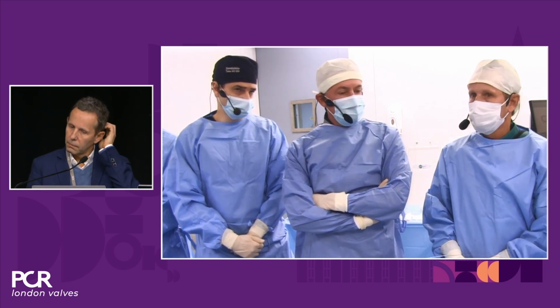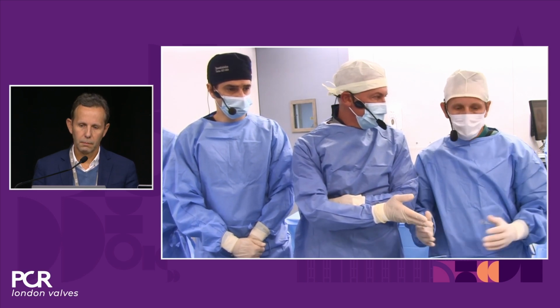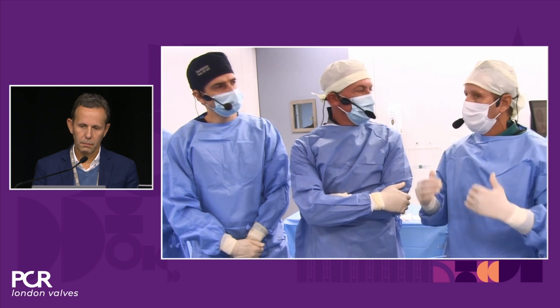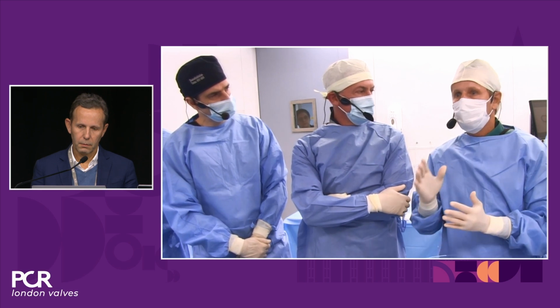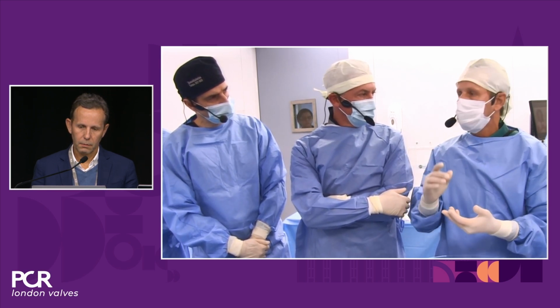Great. And also another important issue is access, femoral access. Yes, and for access, we use the non-contrast CT to evaluate calcification, and we also use CO2 angiography to see the shape of the vessel, size, site of puncture, and everything.